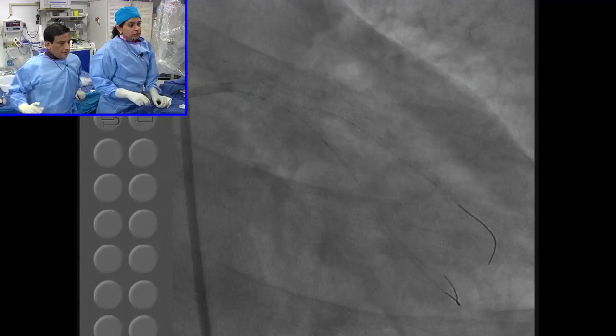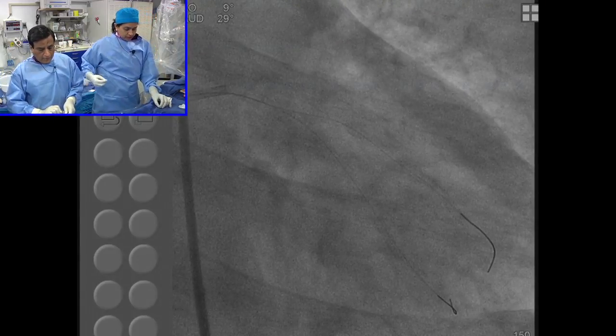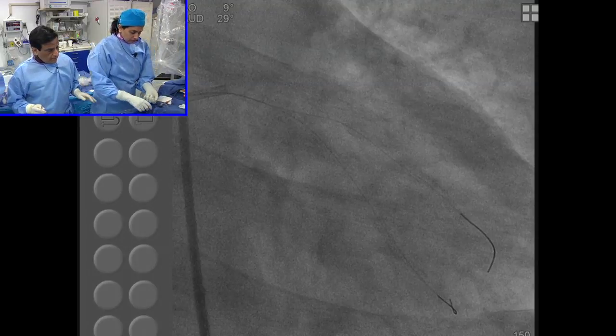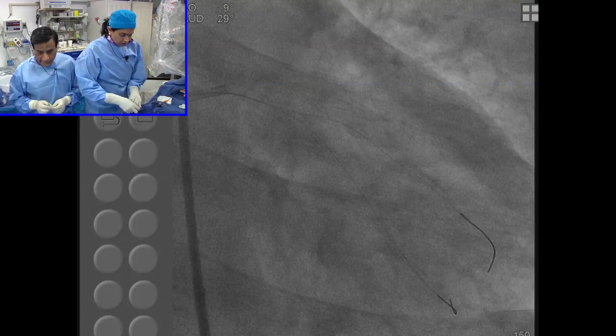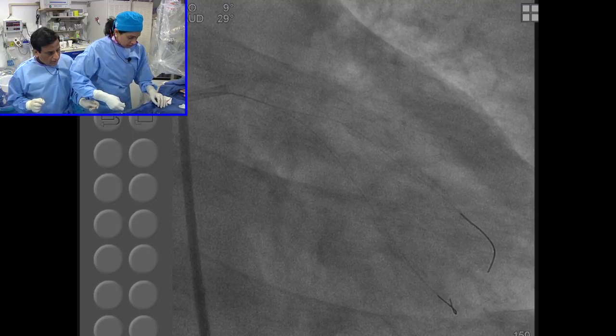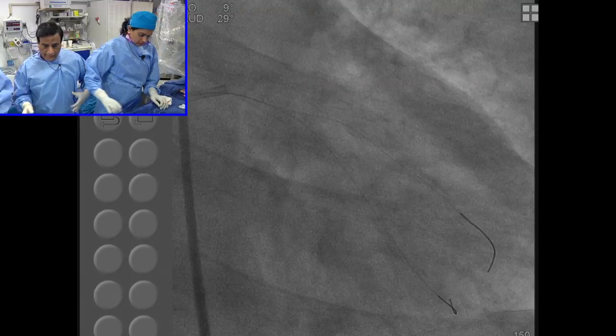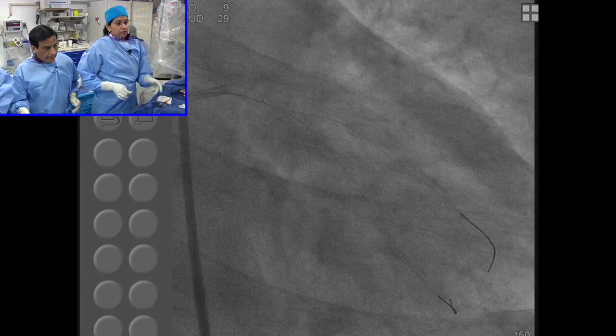Keep talking also. What's the strategy? What are we doing now? We have put a stent, 2.25 20, now. You saw the distal area did not expand completely. So rather than going with a high pressure and cause dissection and perforation, it's okay to deploy, then come back and take a picture or just dilate first.